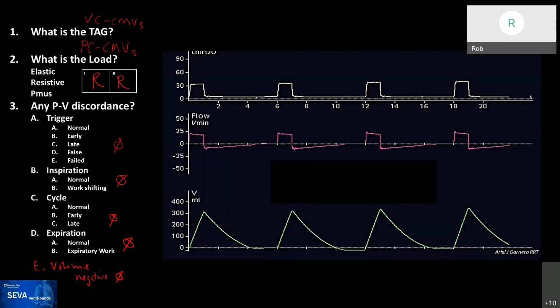So that's a constant pressure generator, that's for sure. But it looks like you have a nearly constant flow. So how on earth can you have, in a single compartment model, constant flow and constant pressure? Well, you can't. What you're seeing here is an R and C for the respiratory system in parallel with a resistance to ground. In other words, a leak, a large leak.